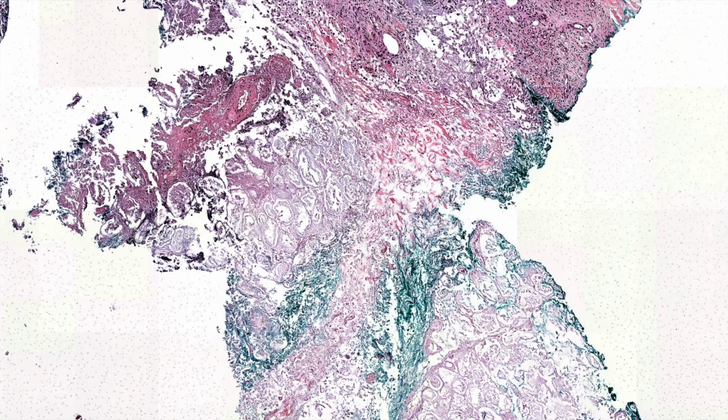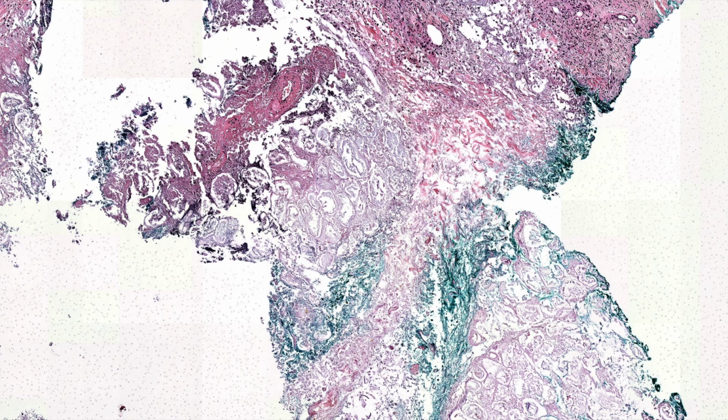When they were taken out, I had the impression they were thought to be tumors. But in fact, the surgeon knew from imaging that these were calcifications, but microscopically, they were not just regular calcifications like you'd see in calcinosis cutis or tumoral calcinosis. They had this saponified pattern.